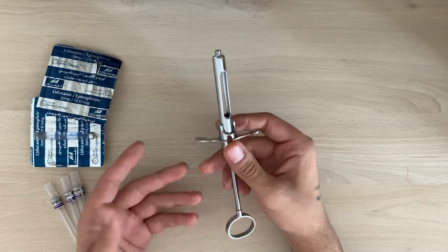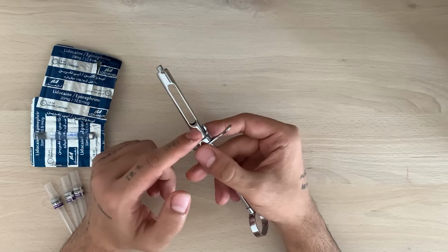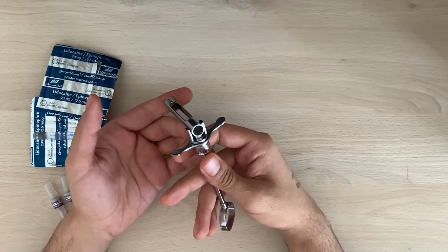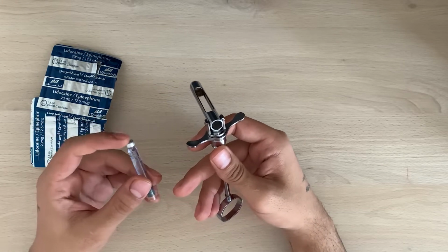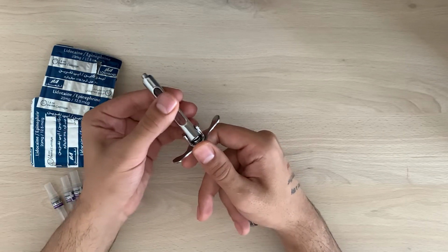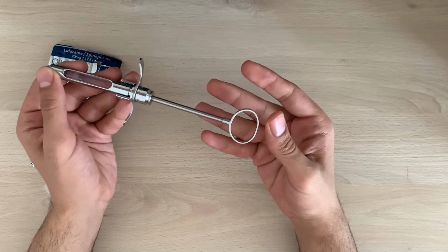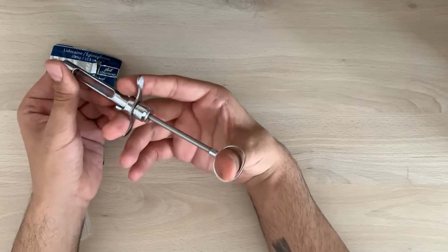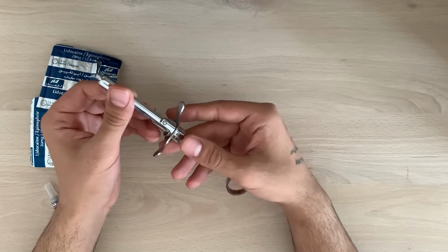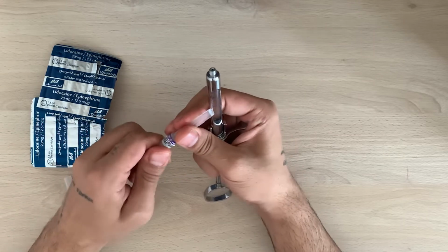Okay, let's try to assemble this dental syringe. The first thing we need to do is add the carpule in the barrel. So we open the dental syringe and add the carpule inside from this side, the needle side. And we close it. Now we need to engage the harpoon by putting some pressure with the thumb ring. And the last step is to attach the needle, so we try to do it straight.